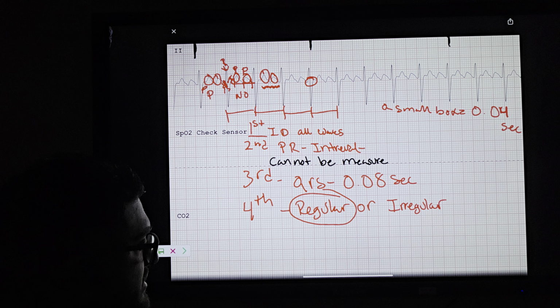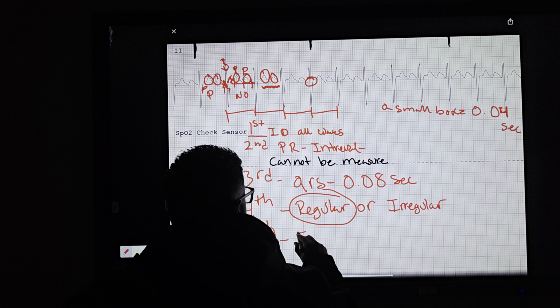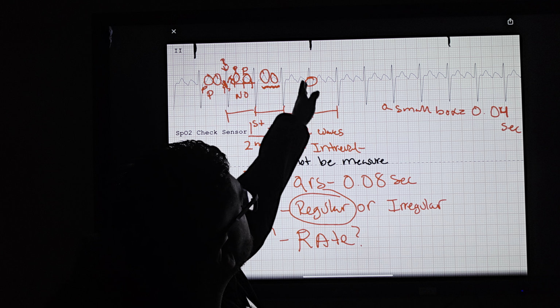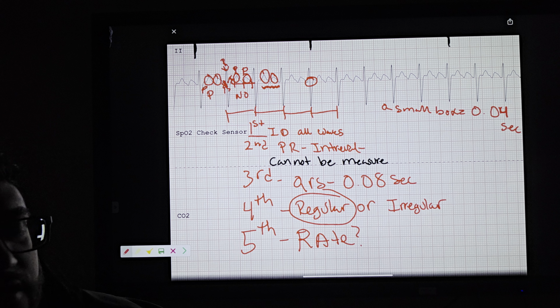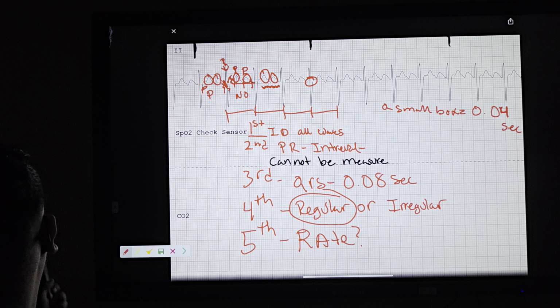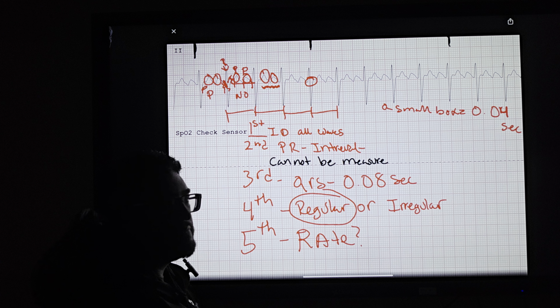Now let's look at the rate for the fifth. I put little lines there to indicate your 3 to 3 and then 3 to 3. So you have a 3 second strip, 3 second strip, hopefully somewhere on there. I try my best to measure it. If you count in between these, that is your total of 6 second strips.